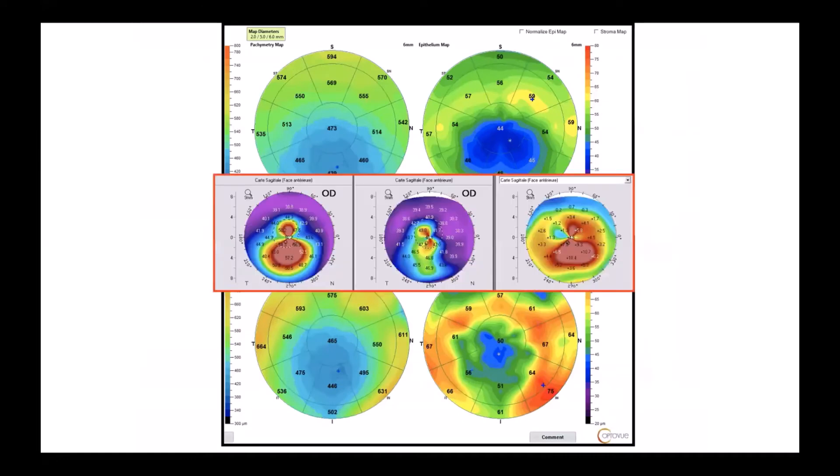Four months after the surgery, you see how the epithelium changes in thickness, especially in the bottom part of the eye. If we compare the epithelium and the differential map of the topography, we can conclude that it's the same mechanism — the epithelium is very important.